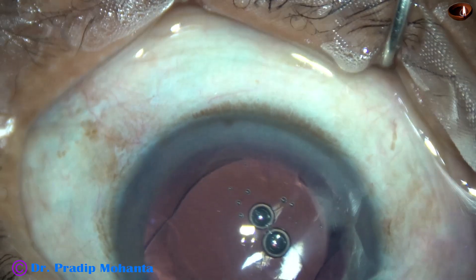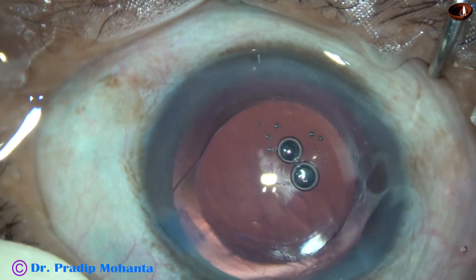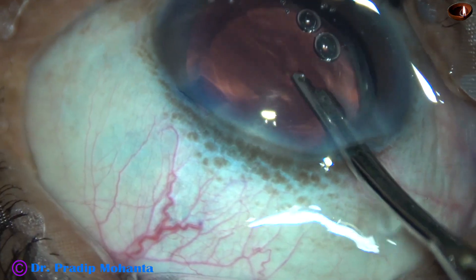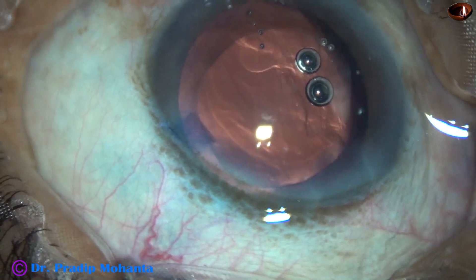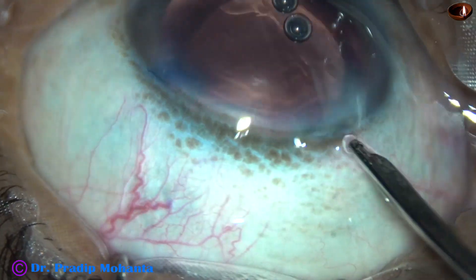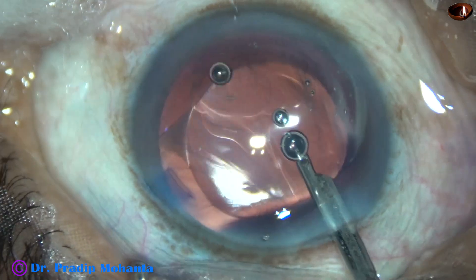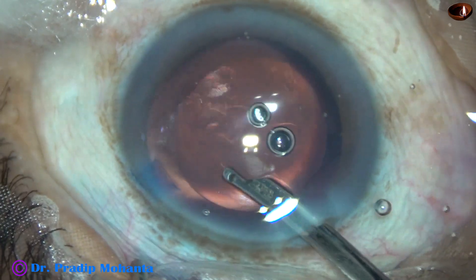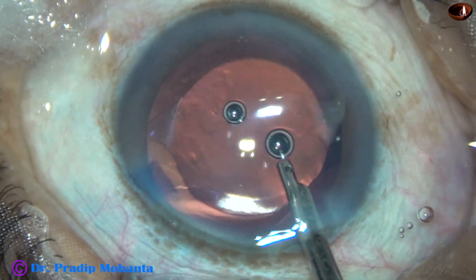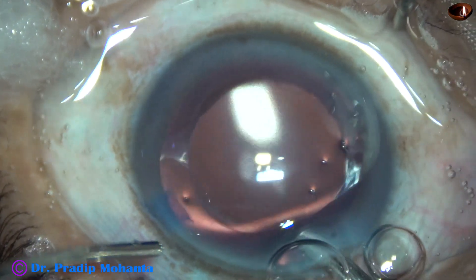The lens has been placed in the capsular bag and now we have to remove the visco from the anterior chamber. I am using only irrigation, flushing BSS from a 10cc glass syringe into the anterior chamber in addition to the irrigation, which is attached to the bottle at a height of about 100 cm. A lot of visco has now come out.